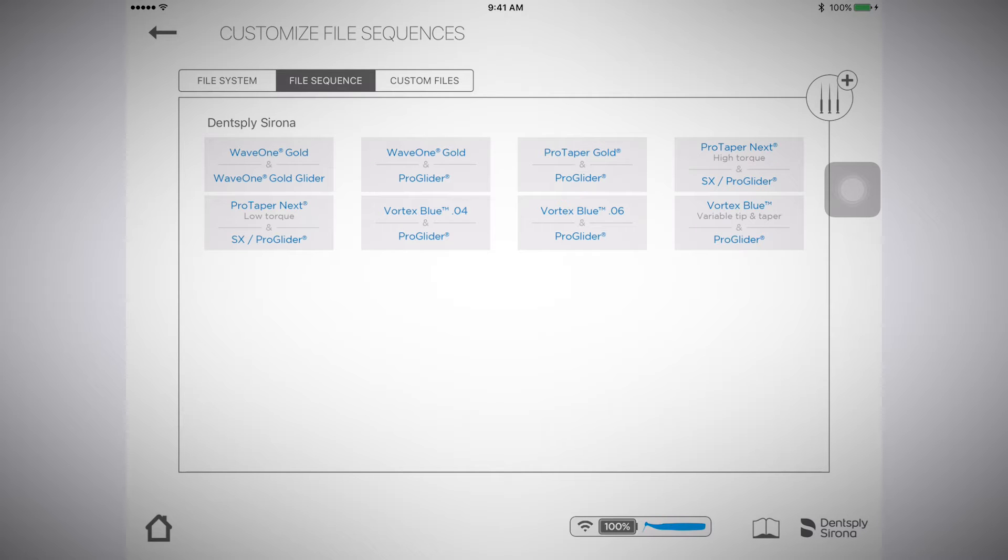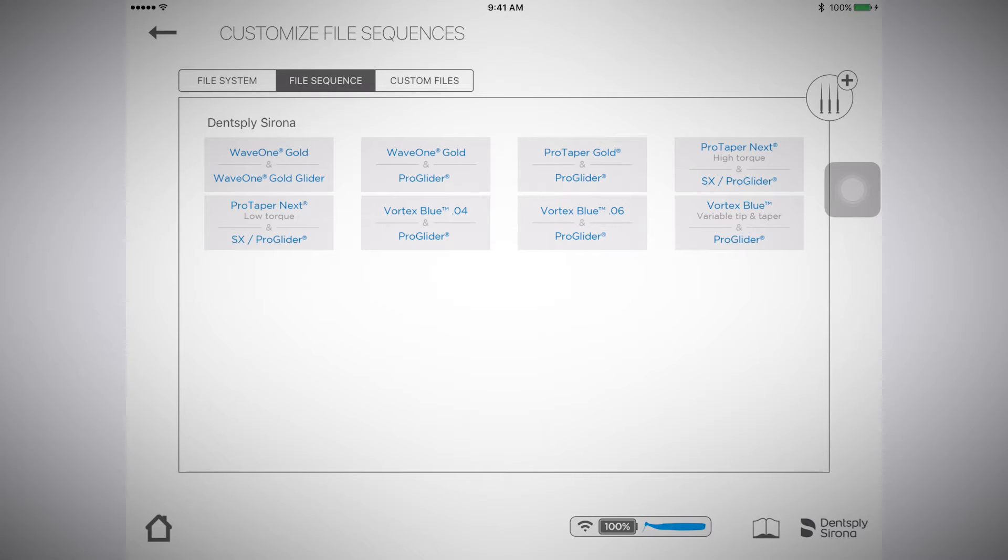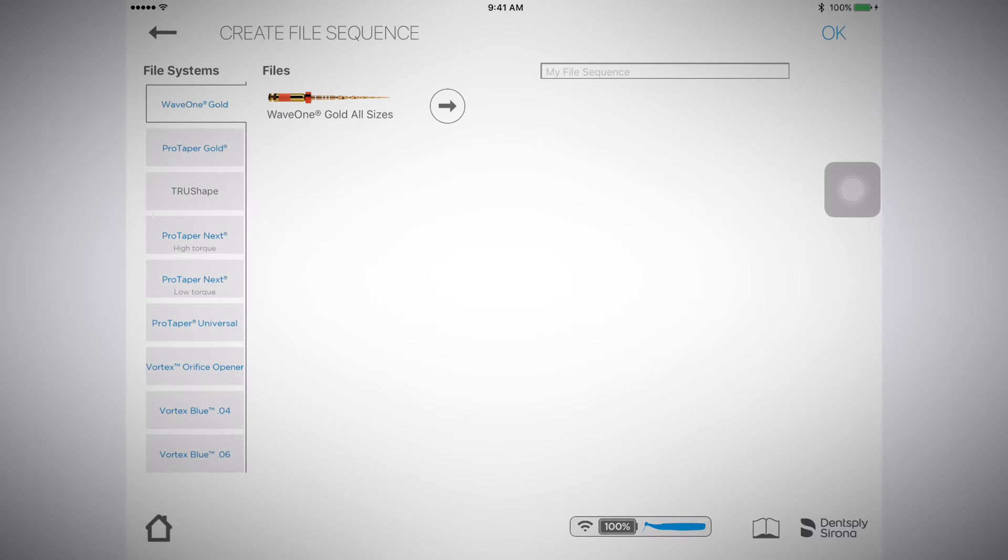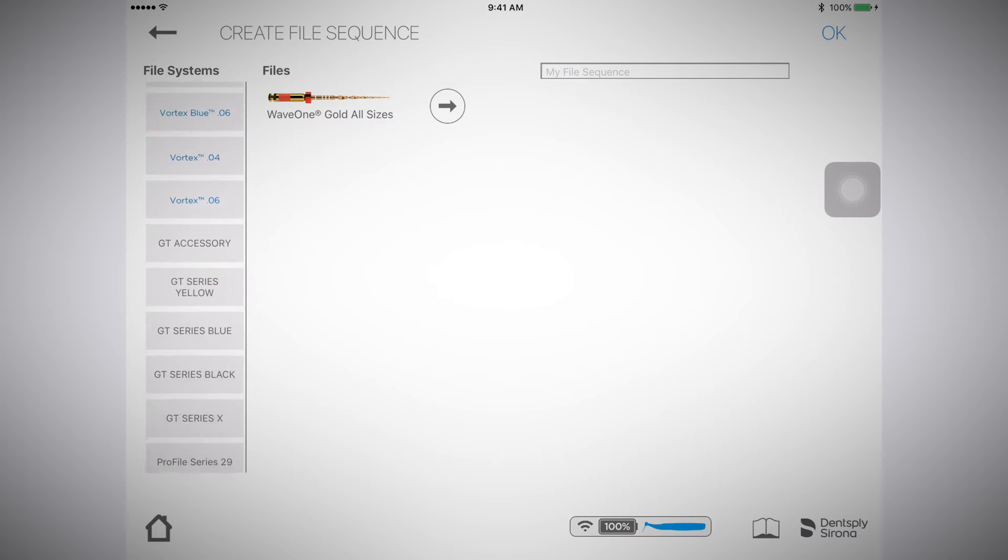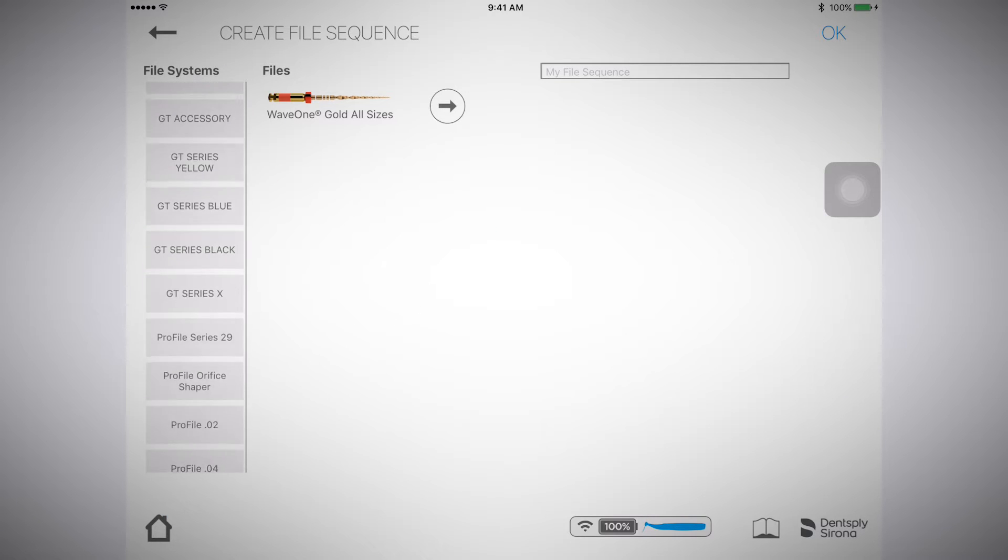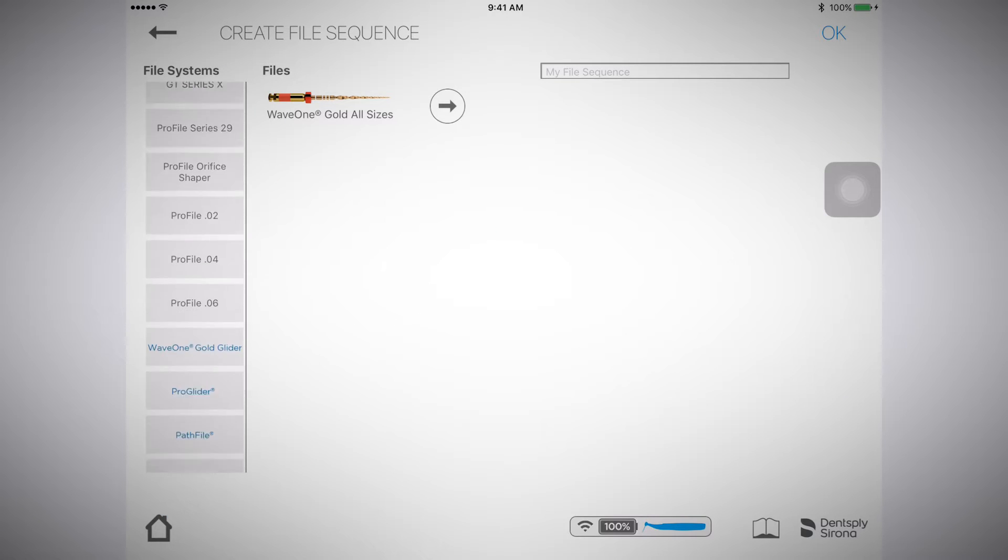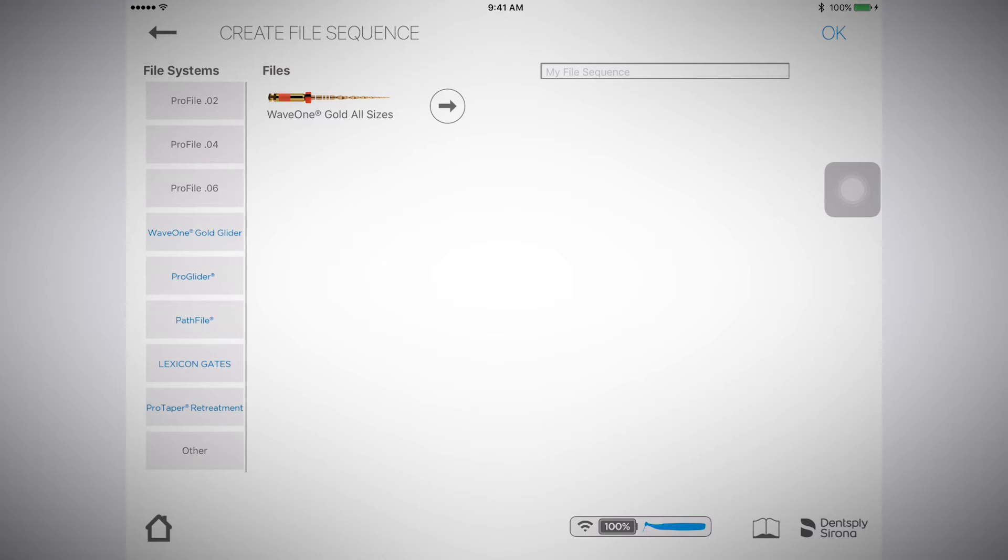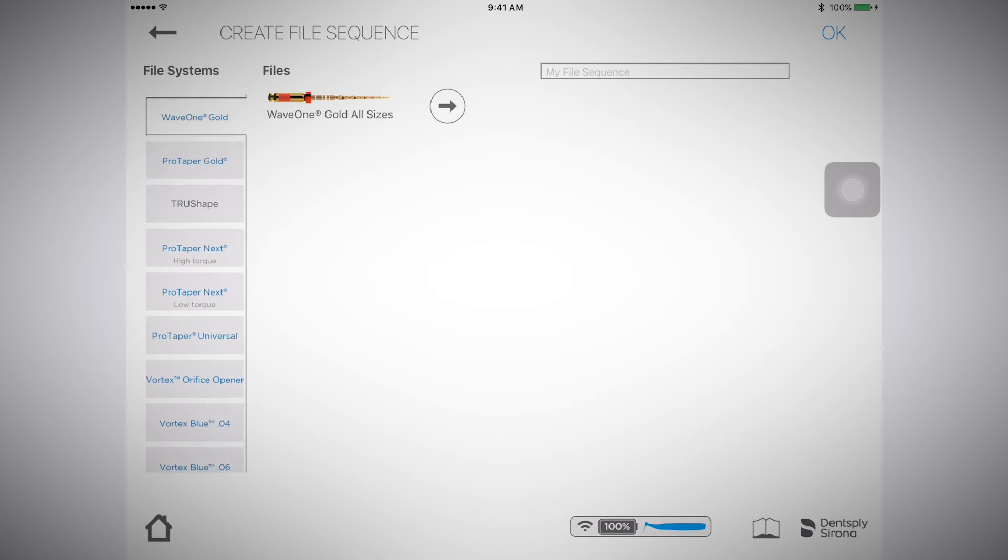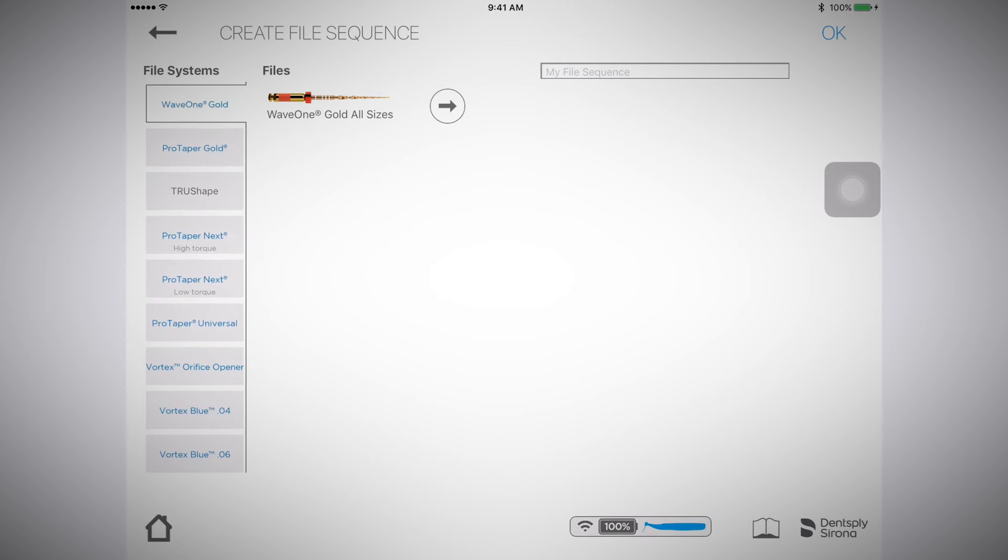There are also options to create your own file sequence. To create a custom file sequence, go to the file sequence tab, select the plus file icon, scroll through the different file systems, and select the file system you would like to use within your sequence.